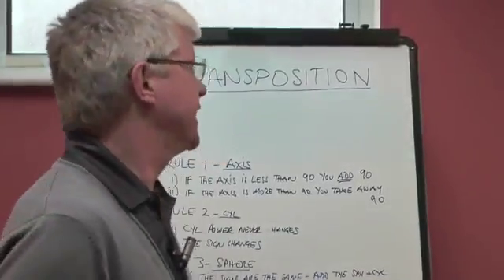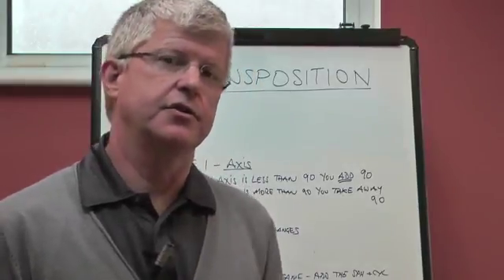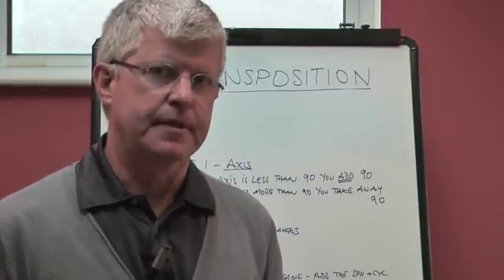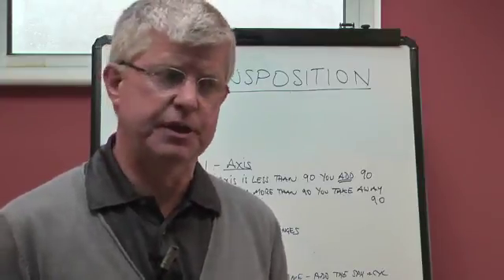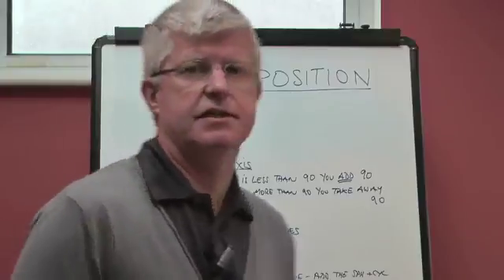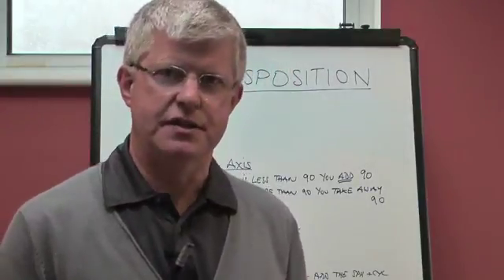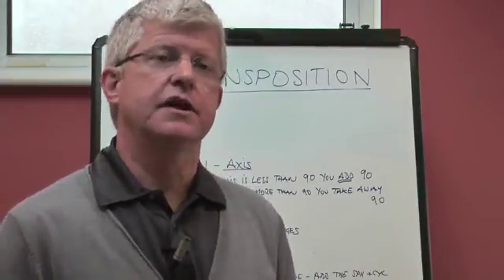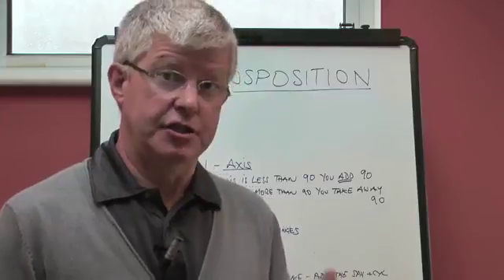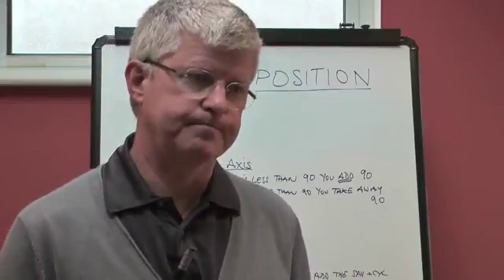Right, we're going to be looking at the subject of transposition, which relates to toric lenses. It's very important to understand how to do transposition, because if you are making up glasses for someone who's got astigmatism, they will need toric lenses, and you need to understand the principles of doing neutralization and transposition in order to make up glasses for that particular person.